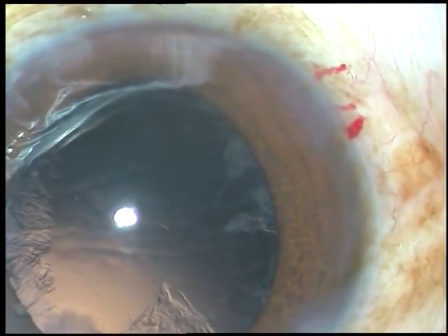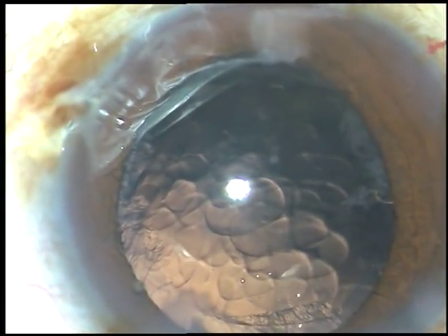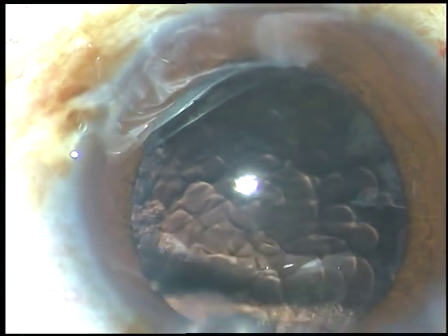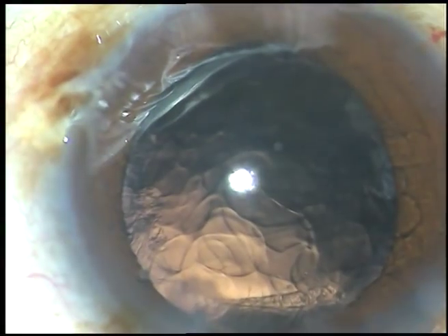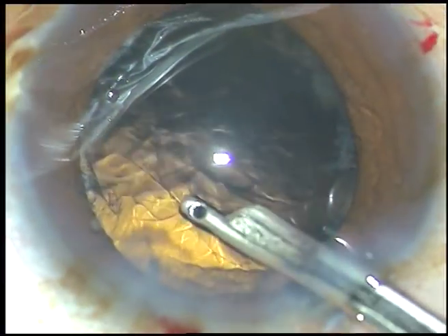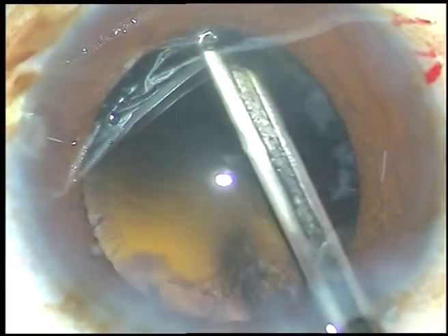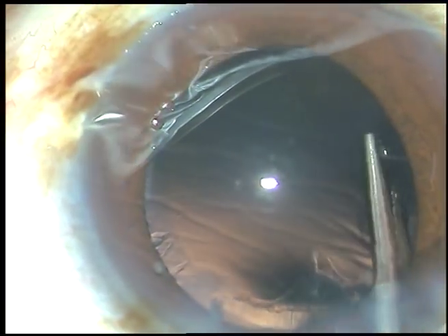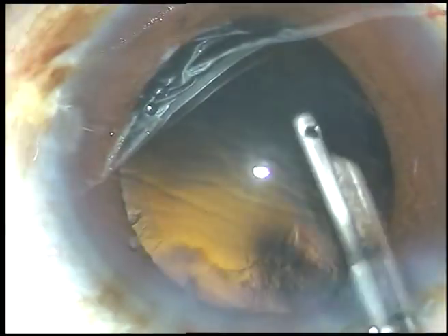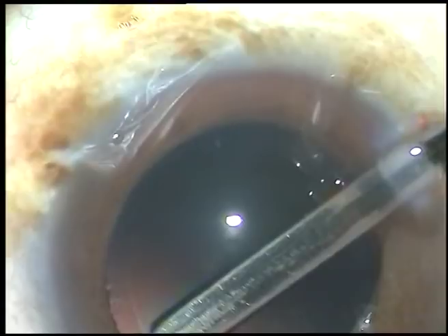I inject viscoelastic substance again. I take a 23-gauge Simcoe cannula and clean the cortical lens matter. There is very little cortical matter in this case because the epinucleus has been incorporated in the nucleus. Cortical matter has been removed.